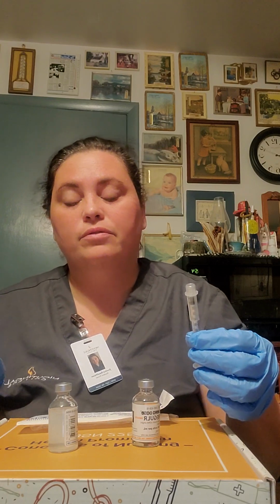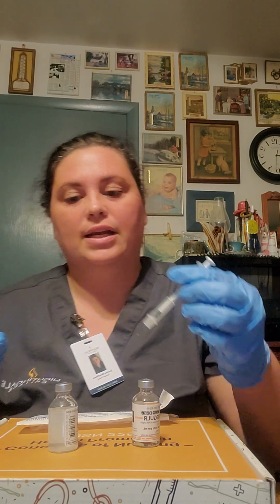I'm going to verify this with my other nurse and my MAR. Alright, so I'm going to insert this needle into the NPH and withdraw 8 units, which is going to be my total of 12 units, making sure that I don't push down on the plunger to inject any of this in.